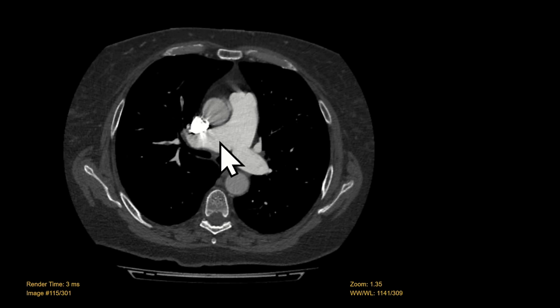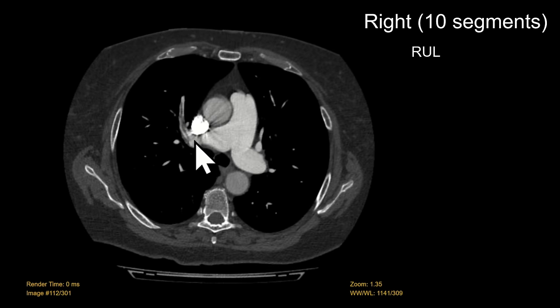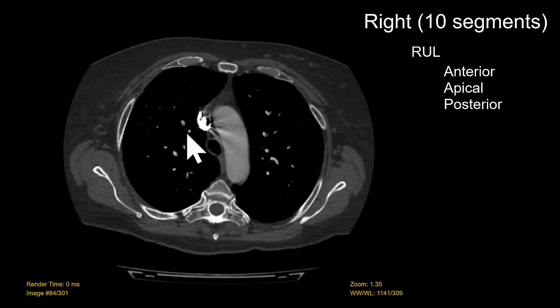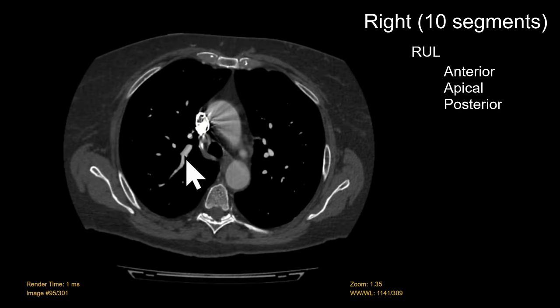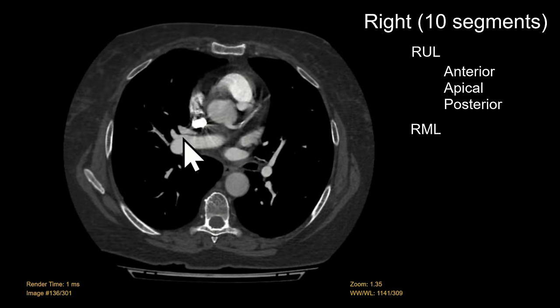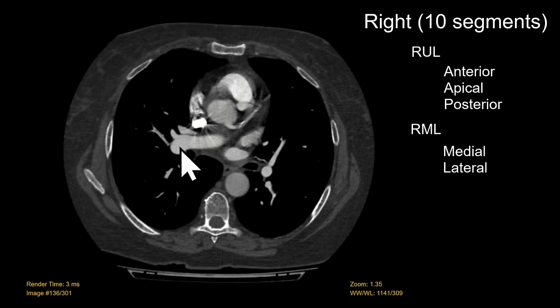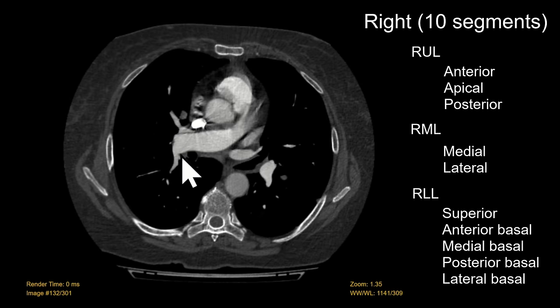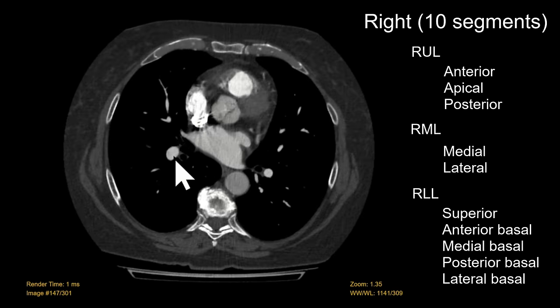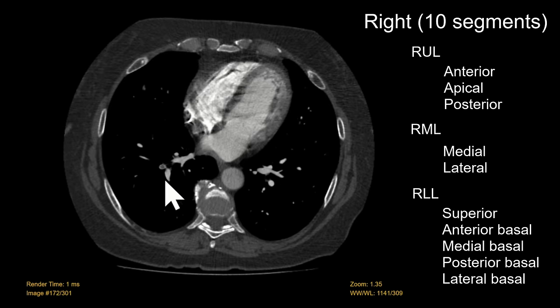On the right it's separated into 10 segments. We can see the right upper lobe with the anterior segment, the apical segmental artery, and the posterior segment. We have the right middle lobe with the medial and lateral segmental branches, and then the lower lobe with the superior branch posteriorly and the four basal segmental branches — anterior, medial, posterior, and lateral.